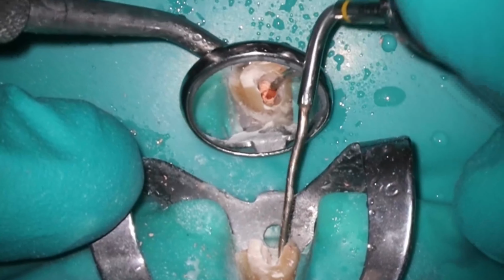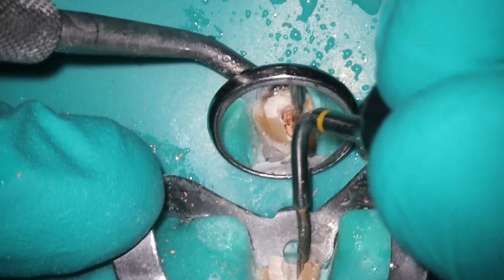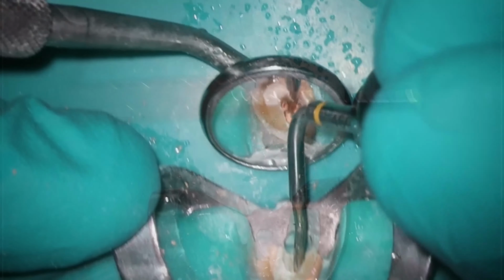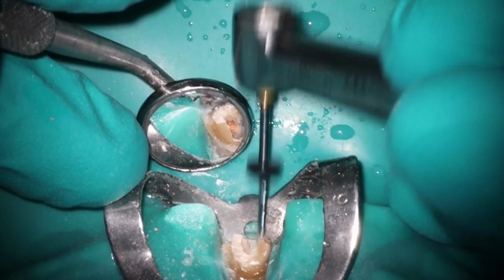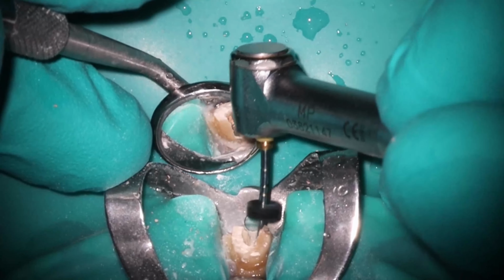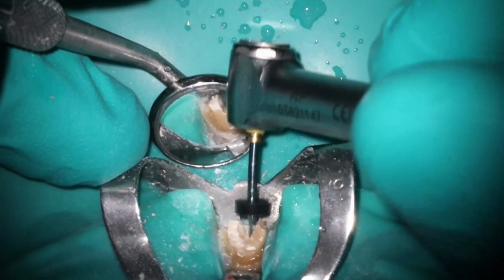I did get a pre-op measurement, and you'll see that come up here because I'm going to be removing this. This was a large shape to begin with, so I'm going to go straight in with the F5 here, and that's why you see me measuring. I am measuring to about a millimeter, maybe 2 millimeters short of what that estimated working length was on the cone beam, because I don't really want to send too much junk flying out the end, but I do want to remove as much of the gutta percha as possible.